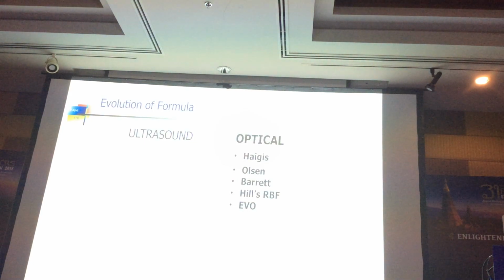But Haigis, if you want to use it for ultrasound, you have to use a totally different constant. You cannot use a constant for Haigis that is not easily available and plug it into ultrasound data. You end up with very surprising results. If you must use Haigis, aim for -0.5 diopter, but the best is to avoid Haigis in ultrasound unless you know what you are doing.